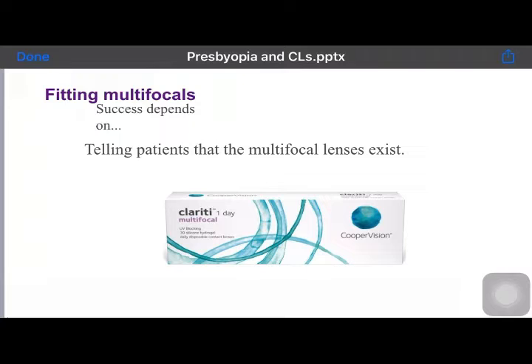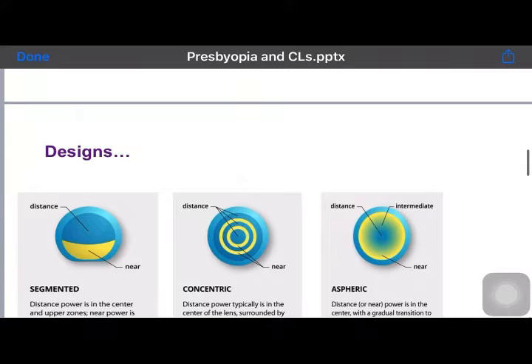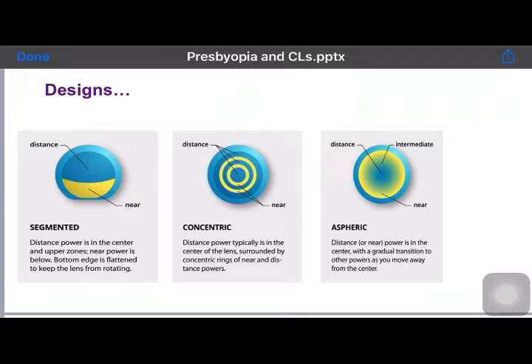Now, before we talk about the fitting techniques, let us first understand what were the three designs of these lenses and how they evolved in design. So if you see the extreme left-hand side of your screen, that was the first bifocal design that was ever there. And it was called a segmented design. It was called a segment because you can see it was divided by a segmented line. So the top portion was the distance and the bottom portion was the near part.